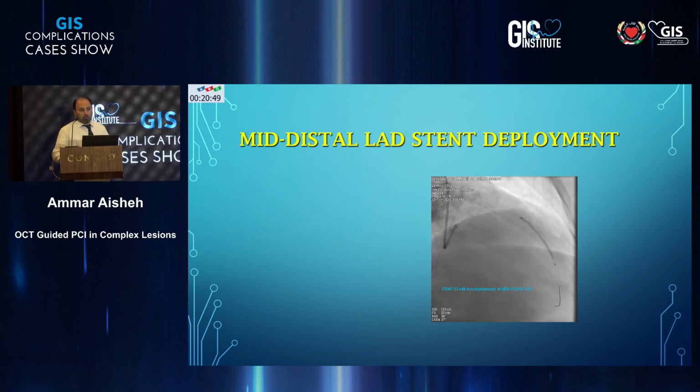Why direct stent? There was no calcium in OCT. Well, I could dispute this, because while describing it as subtotal occlusion, of course you have a very tight lesion, so the contrast is not going to go through when you put the catheter in, so it becomes very difficult to assess. And with the fibrotic tissue, particularly in mid-LAD, quite often you have a lot of recoil. You might get away with it, obviously, but just to make sure, sometimes cutting balloon is the best thing for these lesions to prepare them, then you could put a stent or drug-eluting balloon. Yes, that was the decision of the operator.